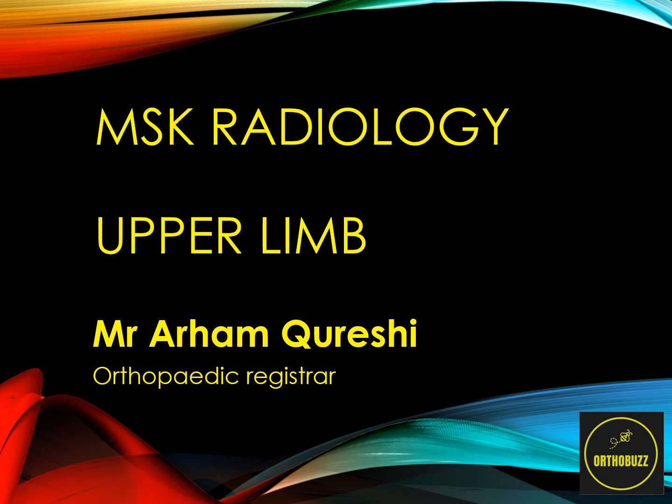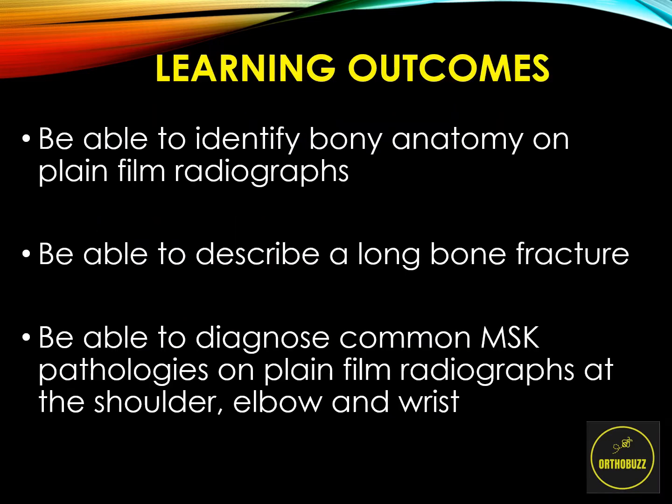Welcome to the next talk. Today we're going to be focusing on upper limb musculoskeletal radiology and having a look at some common cases that you may come across. In particular, we're going to focus on how best to manage these cases, especially in the emergency setting. So what are our learning outcomes?